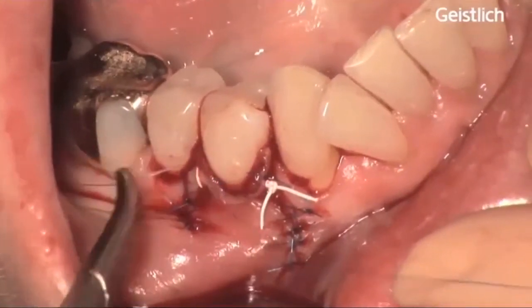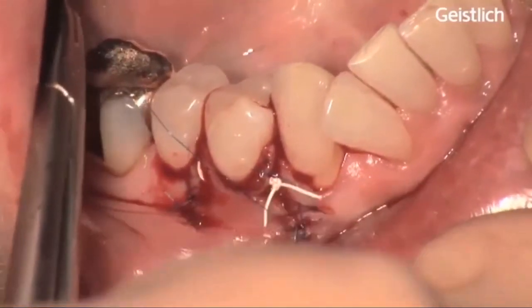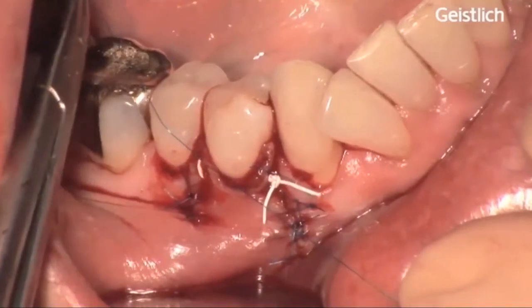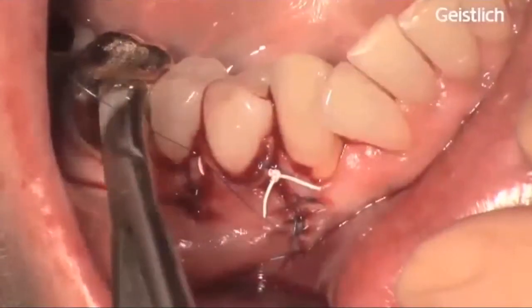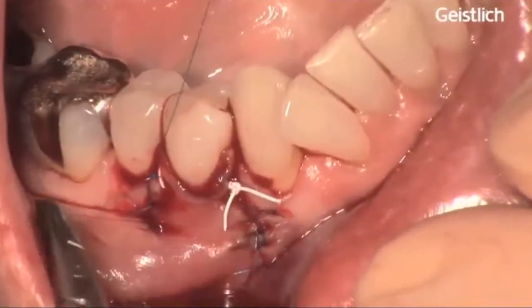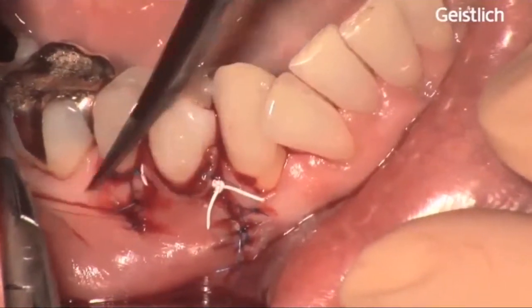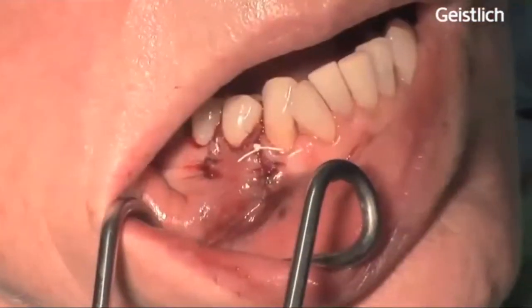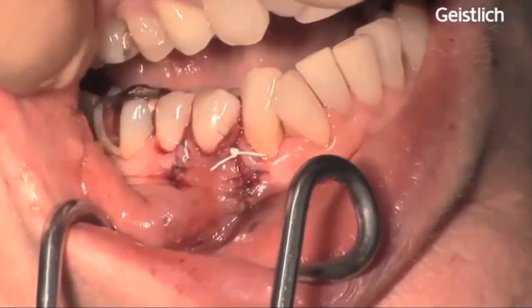At one month after the surgery, an examination of the gingival condition should take place and the patient will be instructed to clean the area carefully with a very soft toothbrush. No probing or scaling is allowed for 6 months.